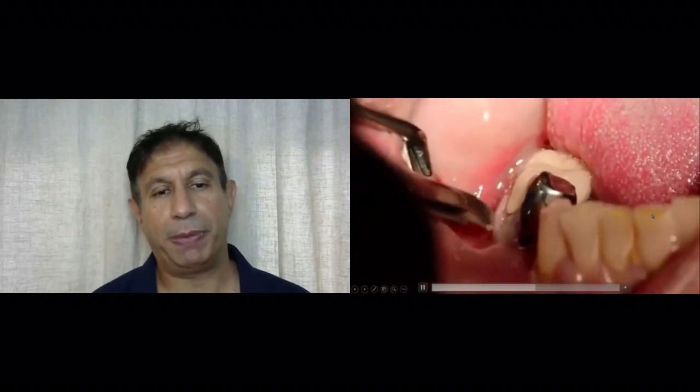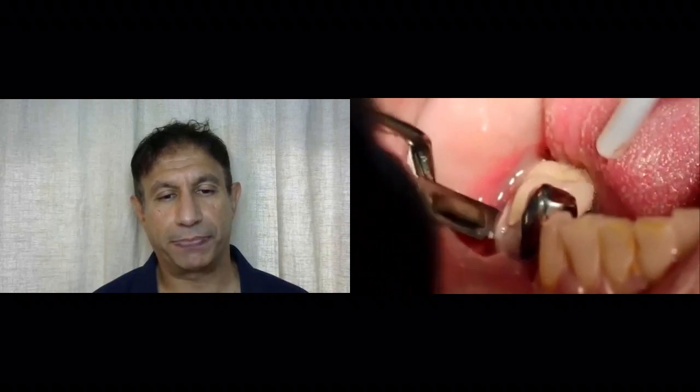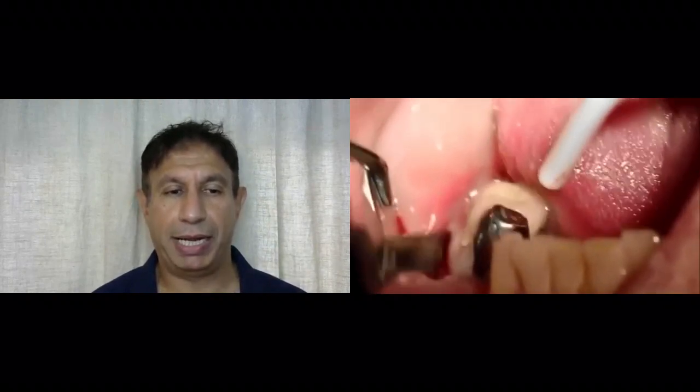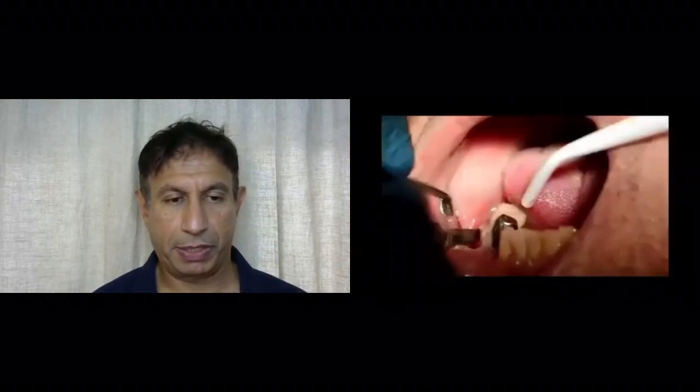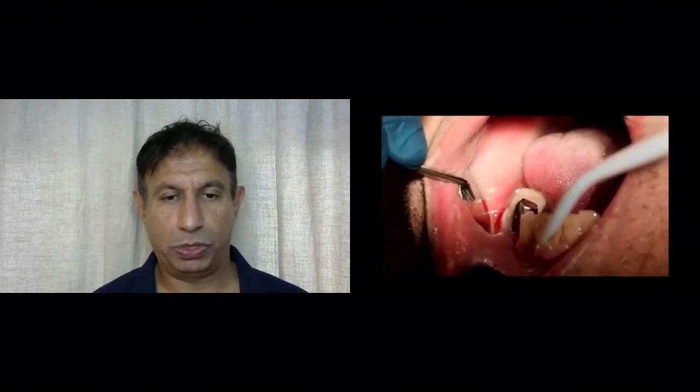So you're putting your blade in and the incision is going from back to front, allowing you to go all the way down to the bone, where the maximum amount of pus is collected with these teeth. So, getting all the pus out from that tooth.